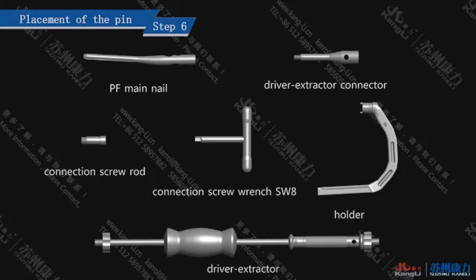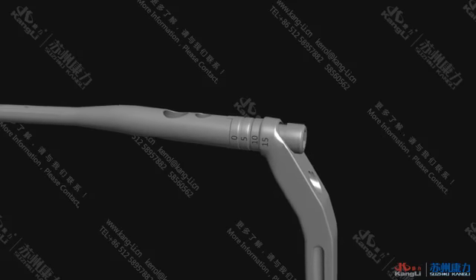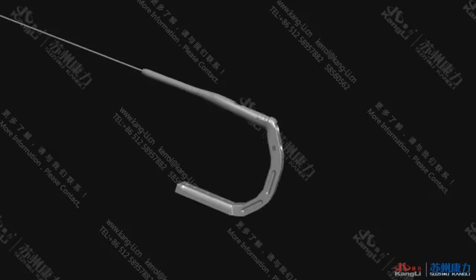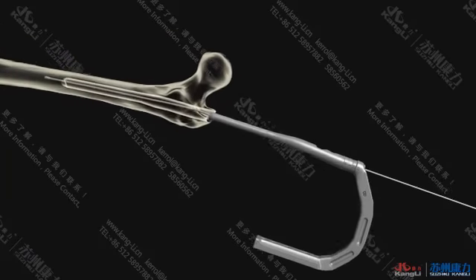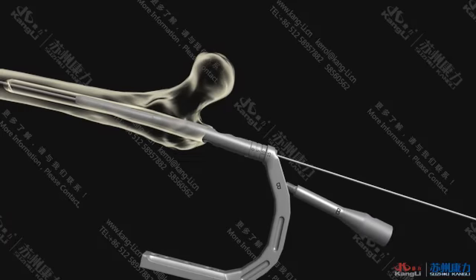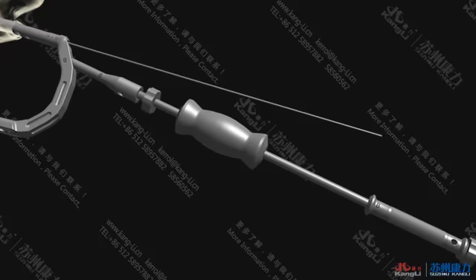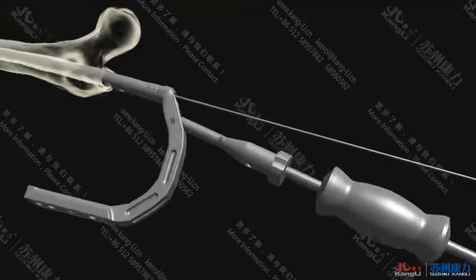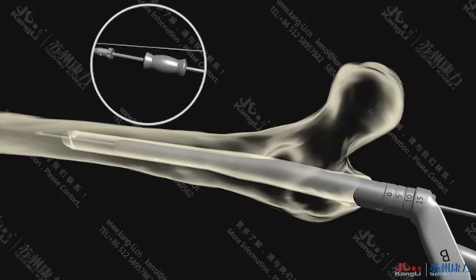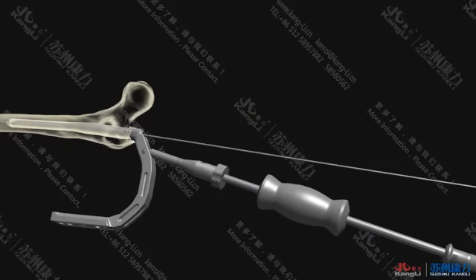Step 6: Placement of the nail. Fix the prepared PF Gamma intramedullary nail onto the holder with the connection screw rod and tighten it with the connection screw wrench. Insert along the ball guide pin and gently swing the holder for insertion. If knocking is needed, install the driver extractor connector onto the holder and connect the driver extractor. Insert the nail by slightly knocking the slider hammer. Remove the knocking devices and the ball guide pin.